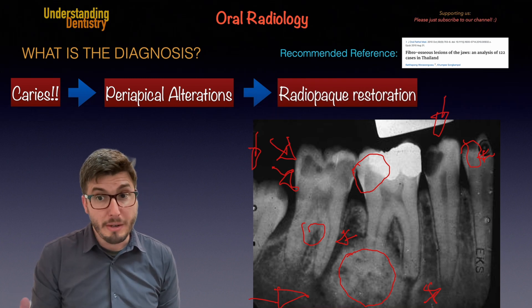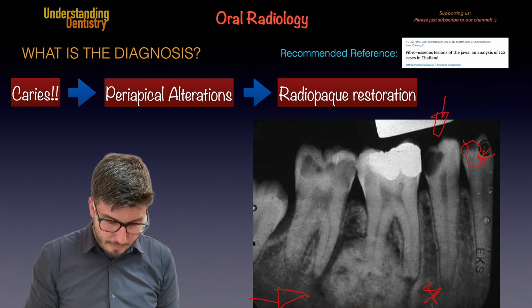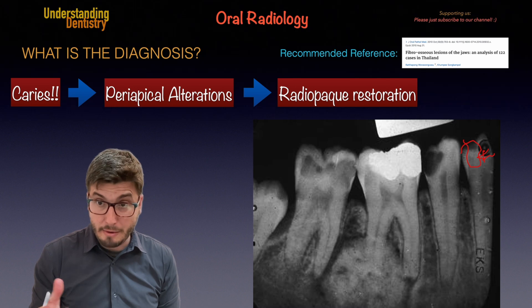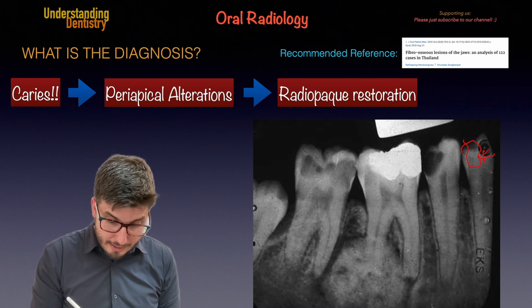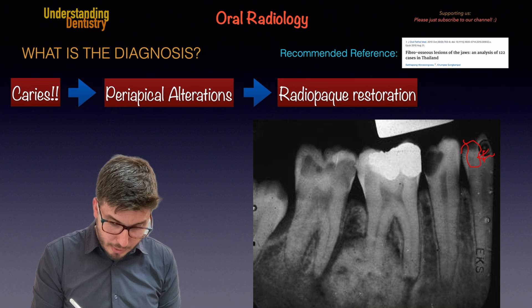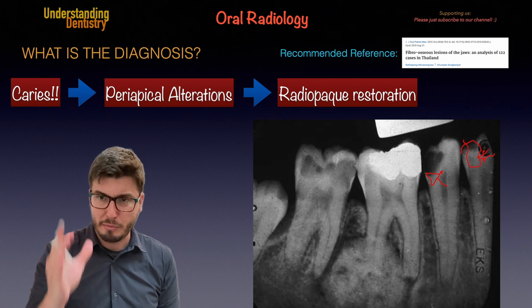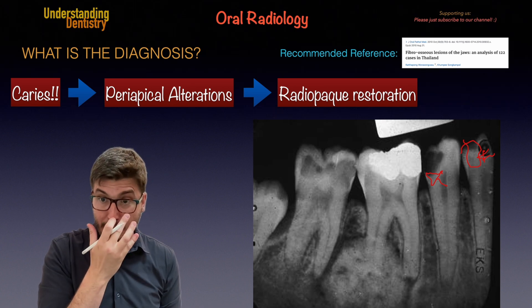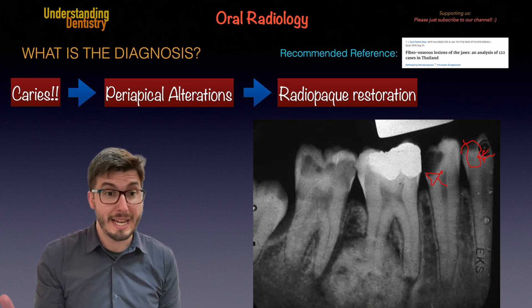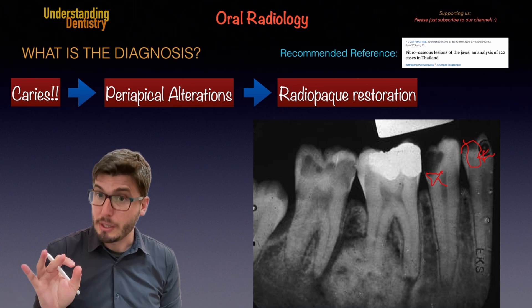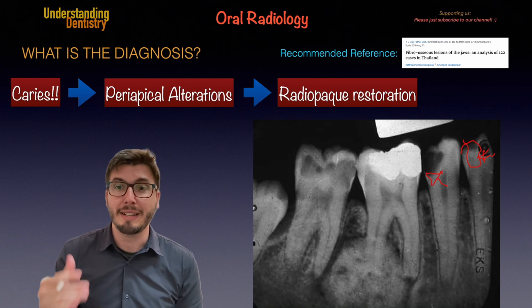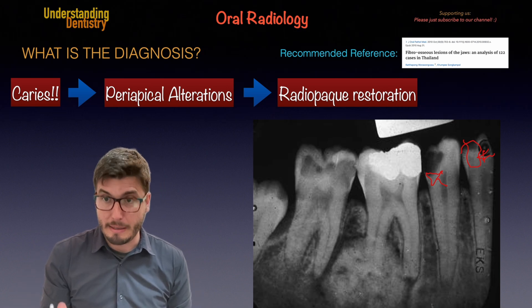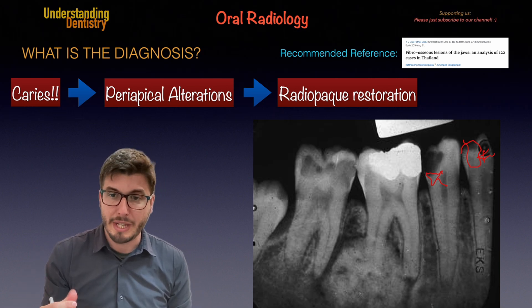We also need to diagnose the radiopaque restoration. Looking at the radiopaque alteration — do we have an overhang? Yes, we have a little bit of overhang. Take a look at this contact point and the shape of this mesial surface — there is a flat shape, it's not in continuation with the enamel below it. So of course that's not adequate. We need to be careful to understand the radiographs and diagnose them carefully.